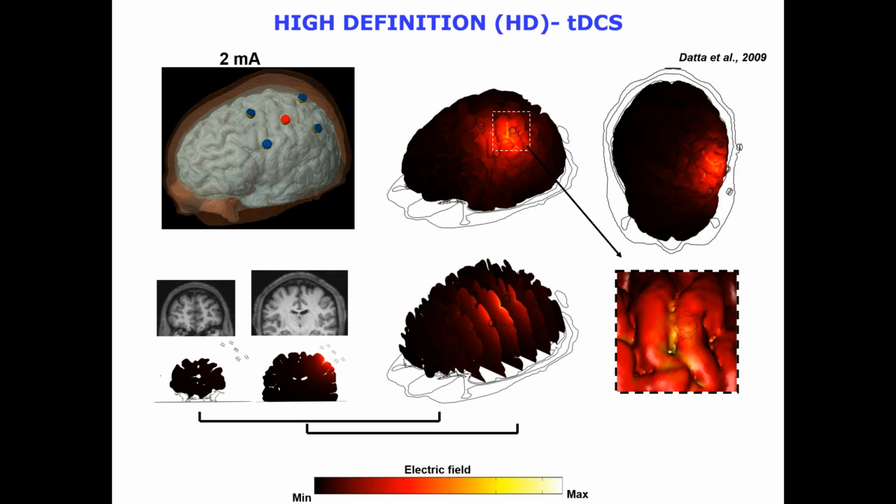So there's no electricity being passed. We're just taking connectivity abnormalities that we think are relevant to the patient's, in this case, executive disorder, feeding back those abnormalities in a form of treatment called neurofeedback, and looking at the changes in their cortex and then in their functioning.